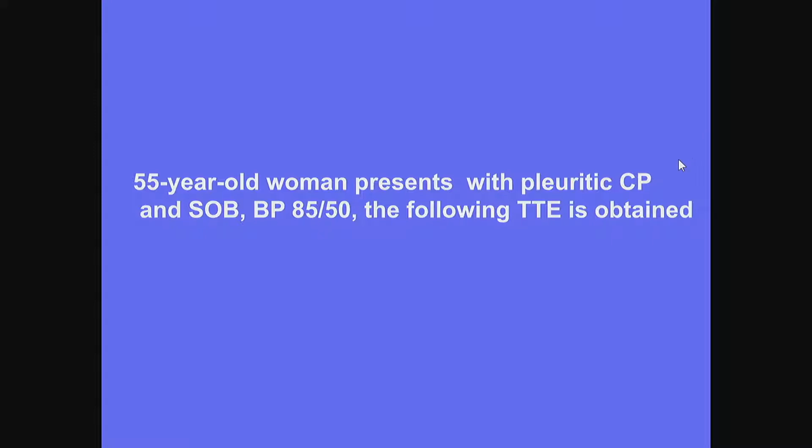So I am going to present you with several echocardiographic clinical vignettes that will be typical of the type of questions you may see on the ABIM exam. Not only on day 2 of the initial certification exam, but also sprinkled throughout the exam with respect to the maintenance of certification exam and day 1 of the initial certification exam.